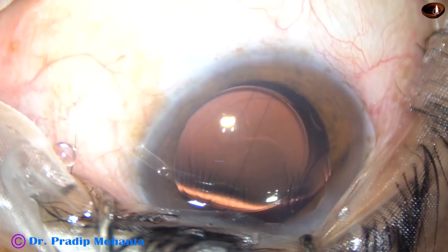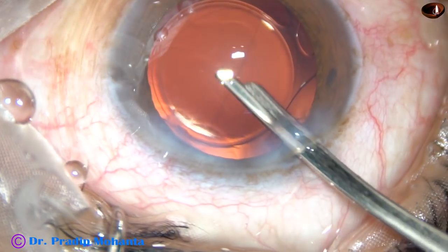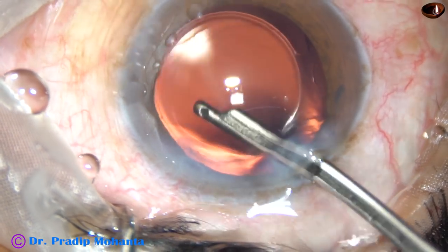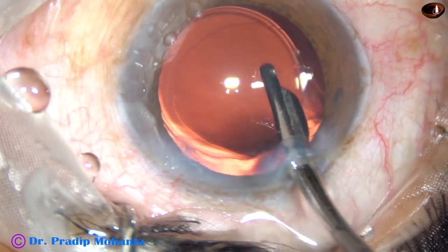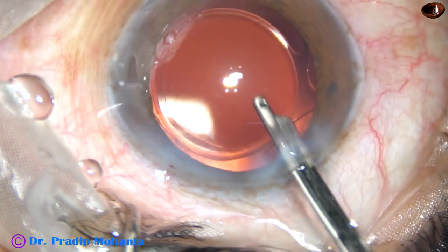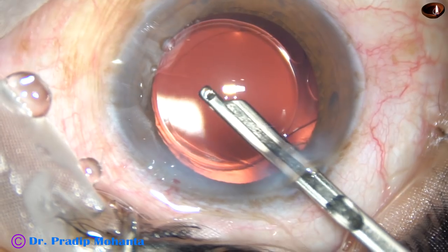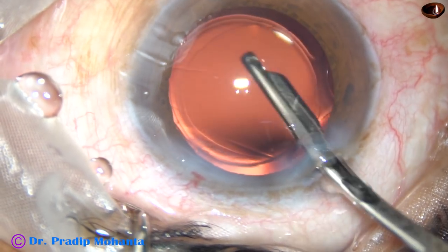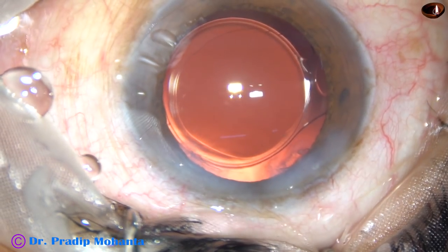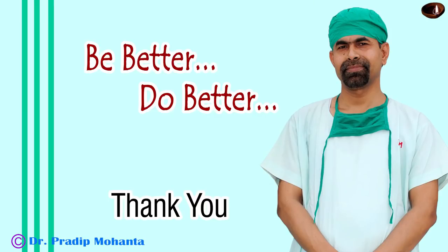The side port is hydrated. This is the final lavage of the anterior chamber. The patient is under topical anesthesia and moves his or her eyes a lot, but you can manage. Once you get used to this, you can instruct the patient to look at the microscope light and get cooperation. The anterior chamber is formed, the wounds are checked — there should not be any leakage from any site. The case is done.